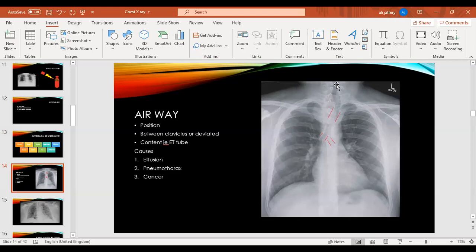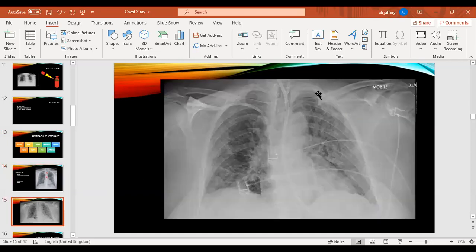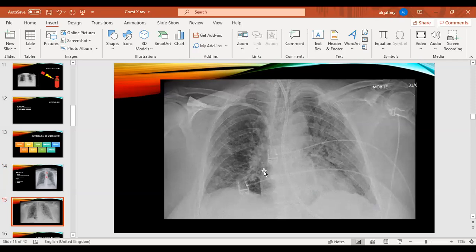If you do see a deviation, always comment on it. Also comment on anything you see in the airway, like a foreign body. For example, in this patient there are loads of lines — a central line, an NG tube, and a thin line which is the endotracheal tube, the breathing tube needed for a ventilator. You can use it to determine whether it's in the right place — you don't want it going down the right main bronchus, otherwise one lung won't get ventilated.